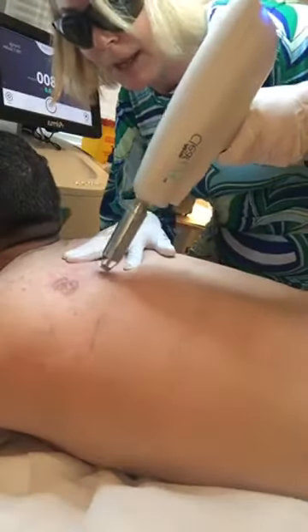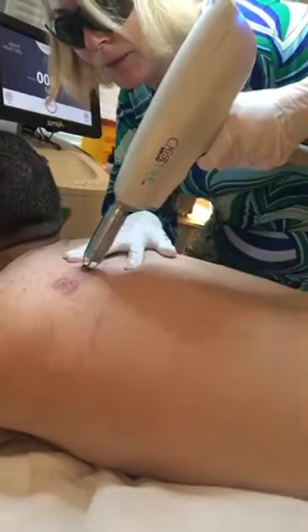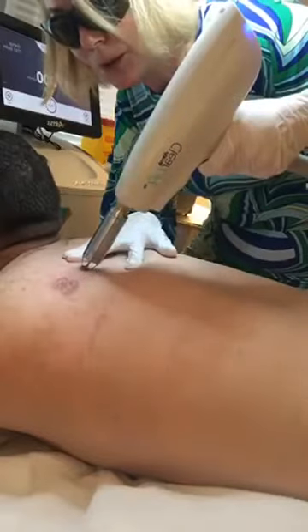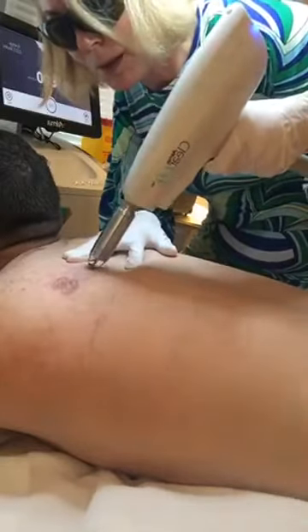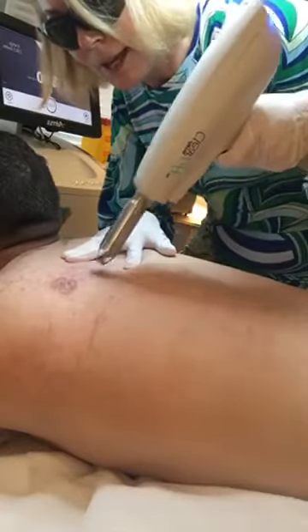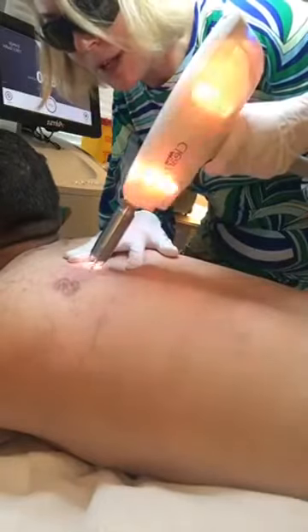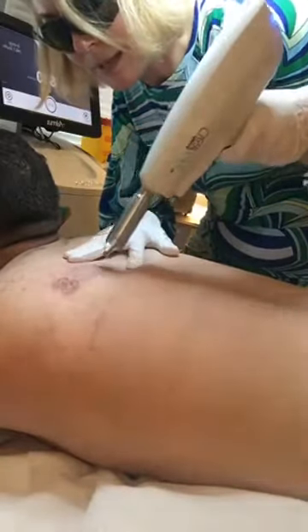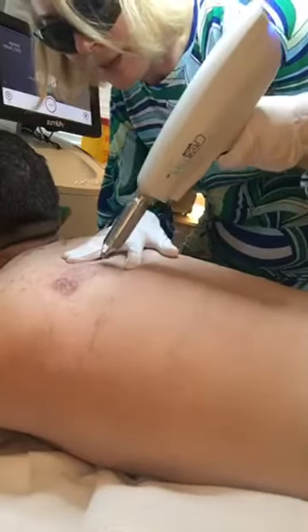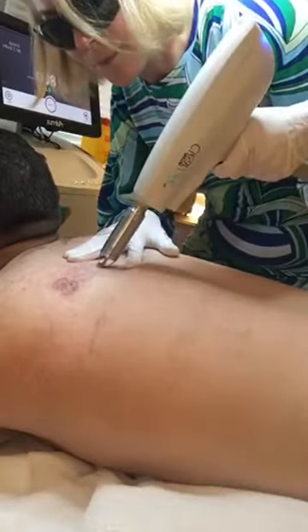We usually do treatments about a month apart — you need that time for the body to do its work. What we're doing here is actually breaking up the ink molecules, which are very large particles — too big for the immune system to get rid of, which is why the tattoo stays. We're trying to break them down into much smaller fragments so the immune system can go in, scavenge them, and clean it up. That's actually how we get rid of the ink.